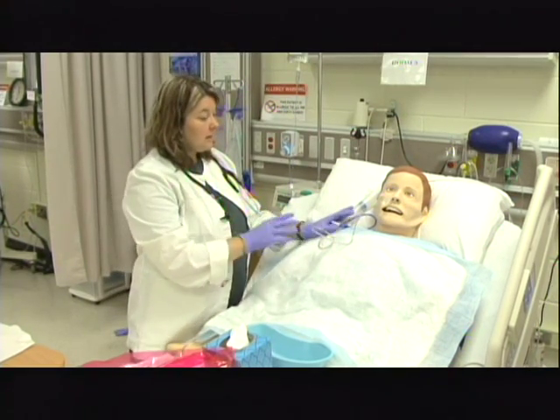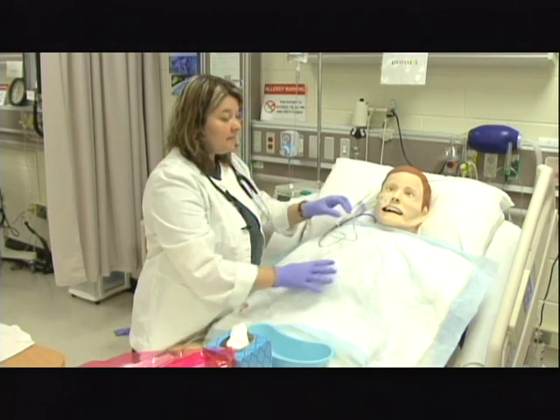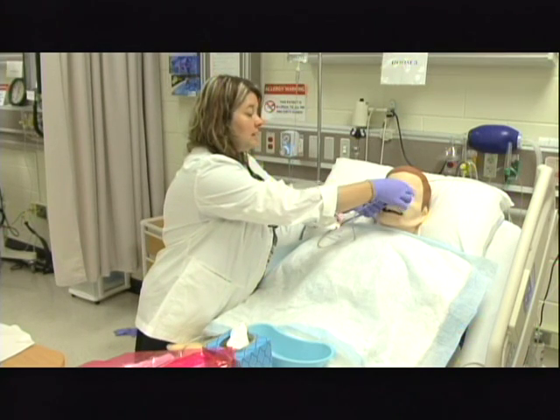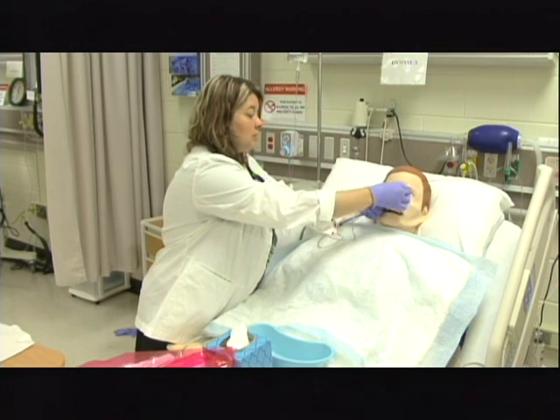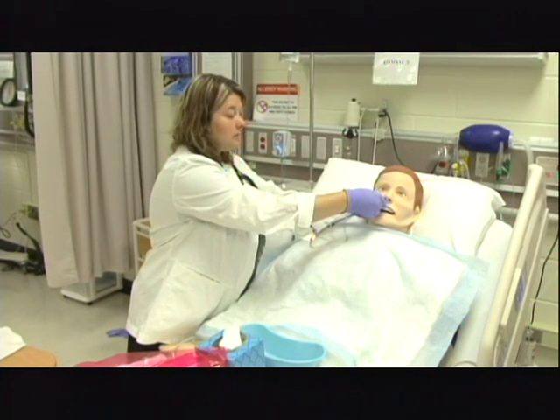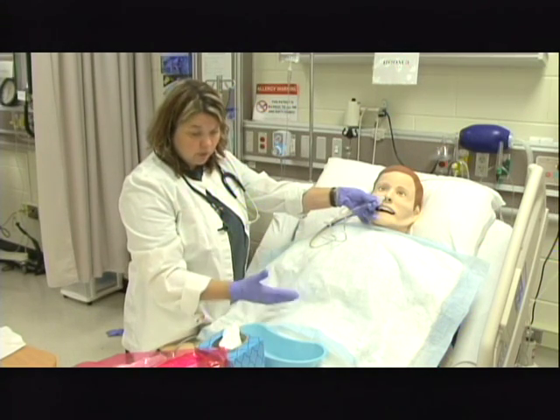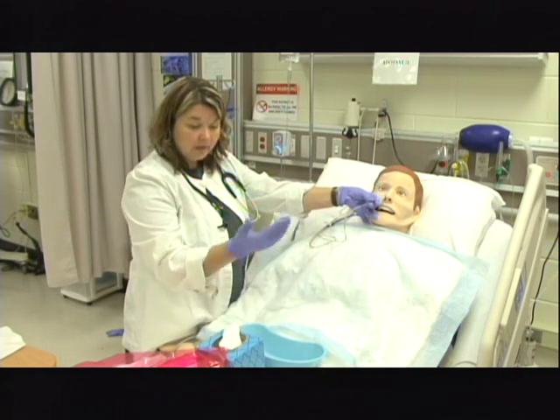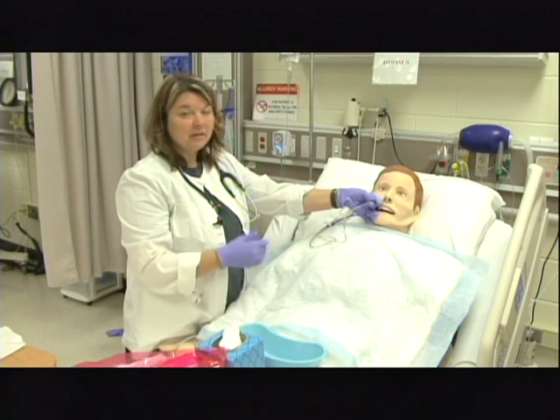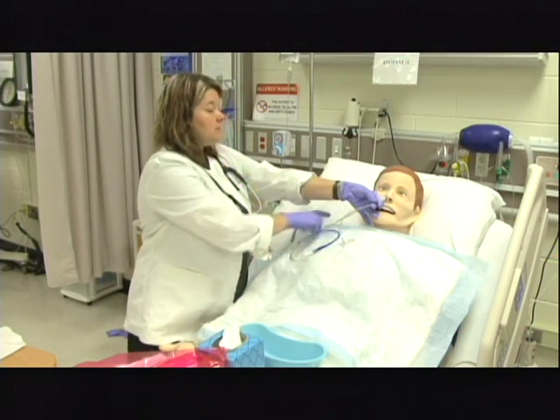Before I get started, I need to explain to Mr. Smith that this may be a little uncomfortable again, and I'm going to have him take a deep breath when I get ready to pull it out. First, I need to loosen up the securement, and you may have something like an adhesive remover that will assist you in pulling it off so that you don't end up hurting his nose quite as much. Please tell him that, make sure if you're having any discomfort, let me know. You would need to discuss this with him before you started if you needed to stop or any of that kind of thing. If he needed pre-medication, we would have already done that. At this point, I'm now ready to instill the air.